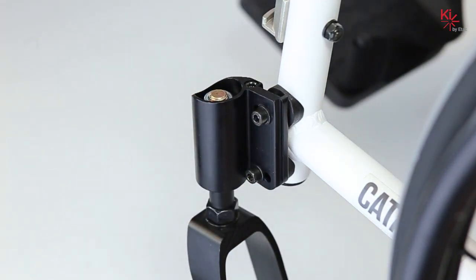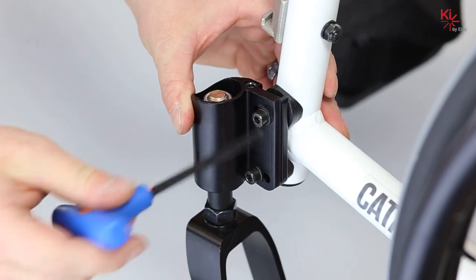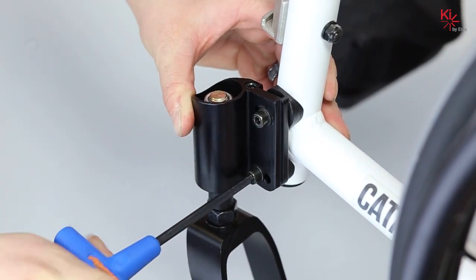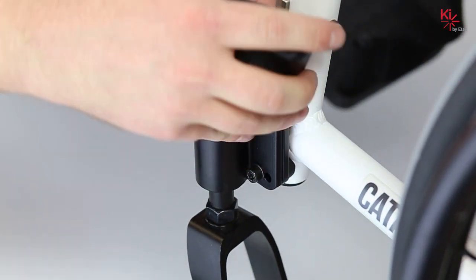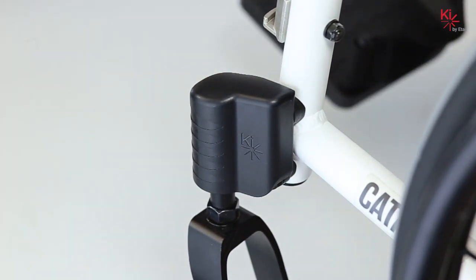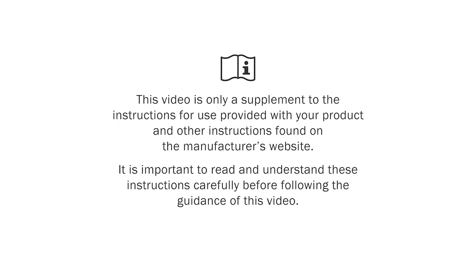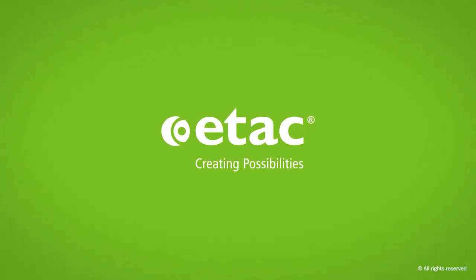Once caster squareness has been achieved, re-tighten the socket head bolts on the outside of the caster housing until secure. Once tightened you can replace the composite cover and repeat these steps on the opposite side.